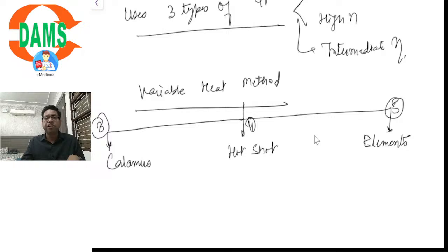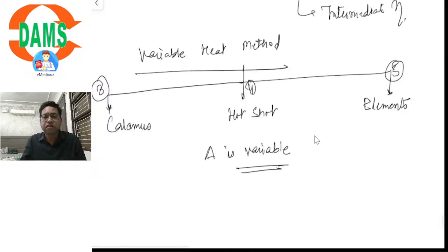Variable heat technique. Because the temperature is variable, we can set the temperature with a thermostat that is available on the devices. But in the case of Obtura, it is fixed at 160 degrees Celsius. In the case of Ultrafil, it is fixed at 90 degrees, respectively called high heat and low heat techniques. So these are the principles and the techniques for the obturation of the root canals.